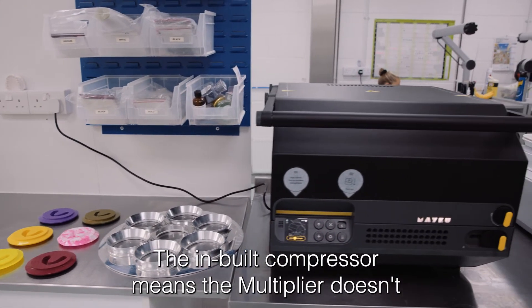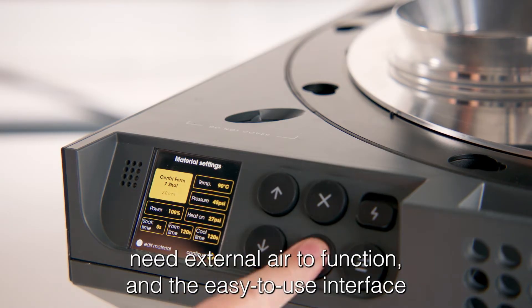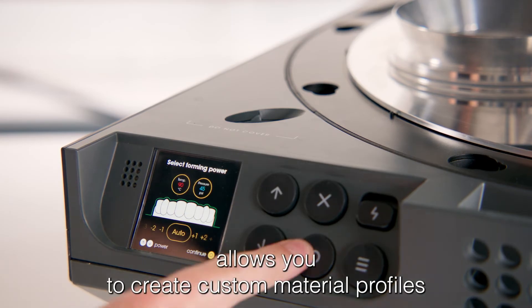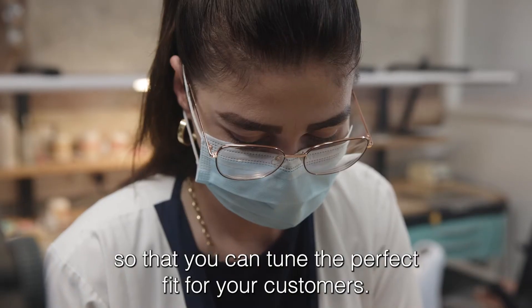The inbuilt compressor means the multiplier doesn't need external air to function, and the easy to use interface allows you to create custom material profiles so that you can tune the perfect fit for your customers.